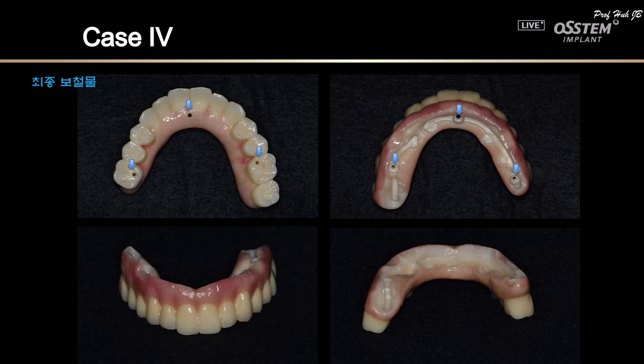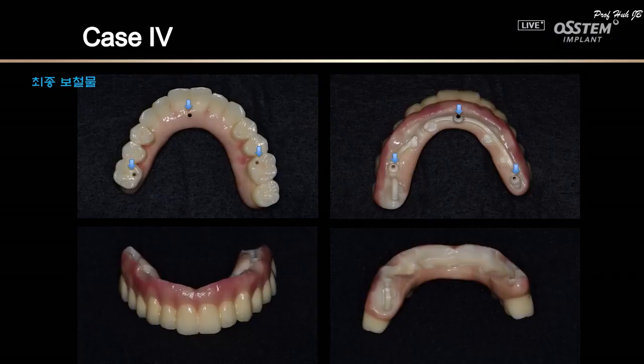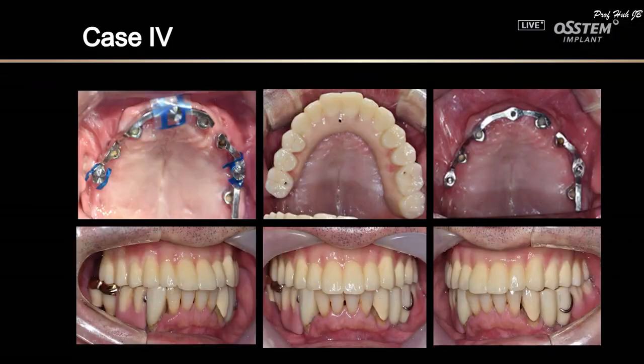The patient suffered too much and the implant fell off. Now the patient is taking it out once a month because not all gingiva is covered and water pick cleaning can be done. So this is how it is used. So this is a fixed prosthesis, but it can be removed.